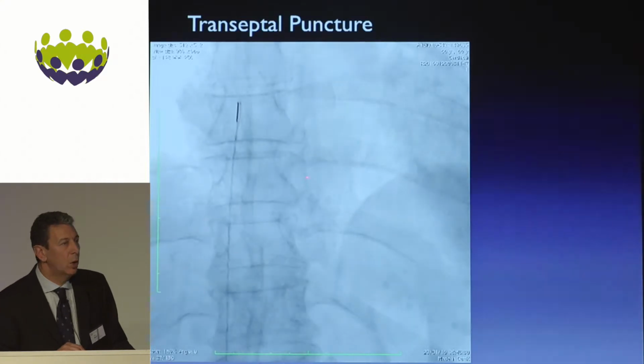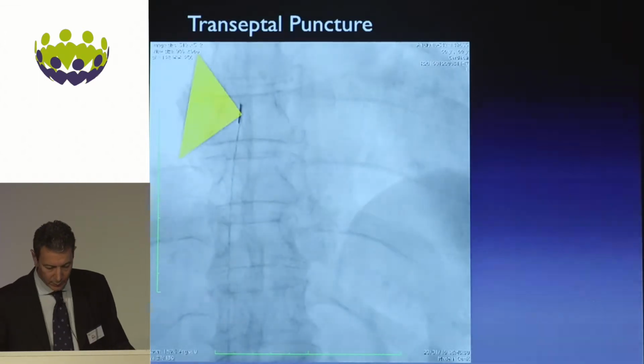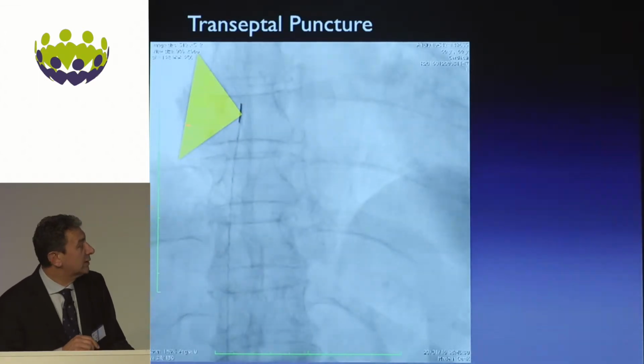Go back to the home view. Rotate the probe counterclockwise and orient the probe to the right side of the patient.